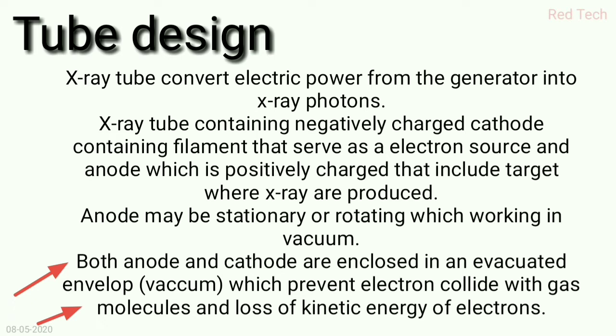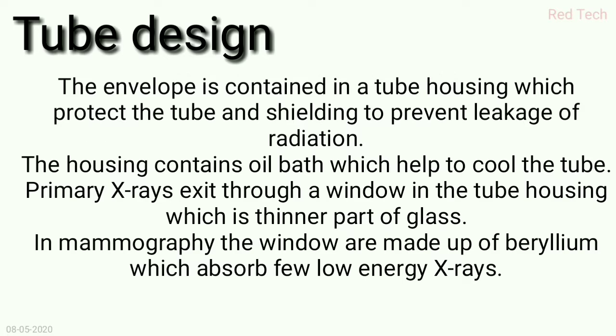Basically, if there is some gas or air present, then when electric current energizes electrons accelerating towards the anode, they might lose their kinetic energy.